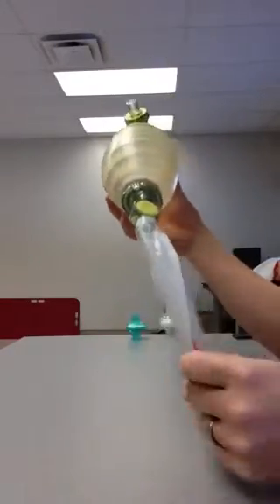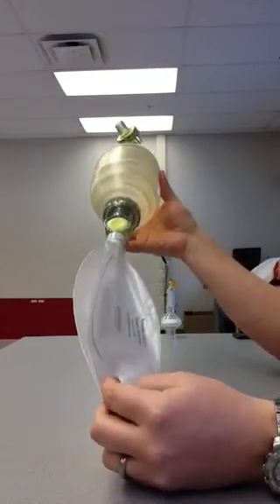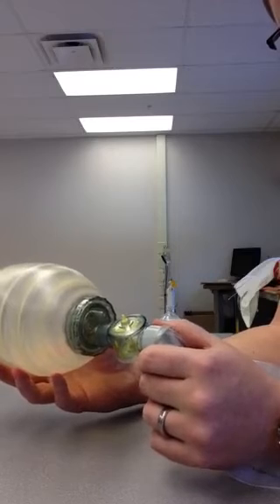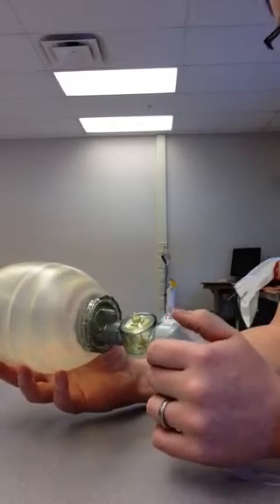Now let's talk about each component of this bag, starting with the reservoir. This is a closed reservoir, adult-style bag. You can see right on the reservoir it says it is a reusable 2.6 liter reservoir. There's an oxygen port here — you would connect your oxygen tubing to a flow meter and run it at 10 to 15 liters per minute.